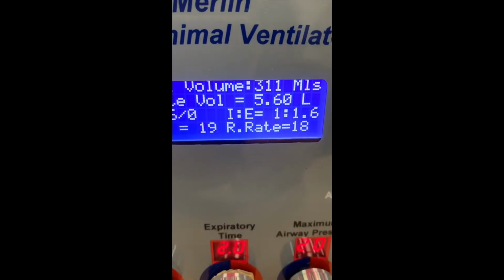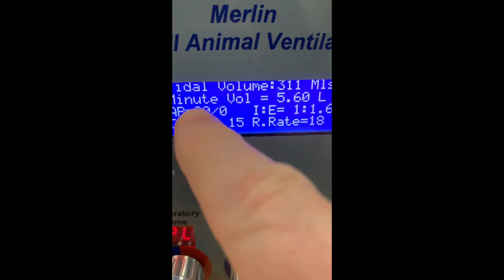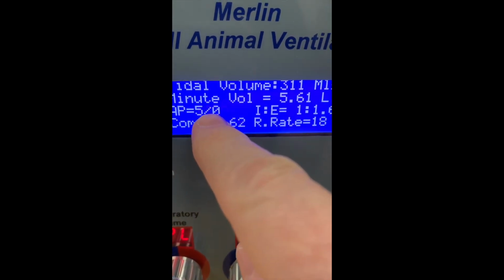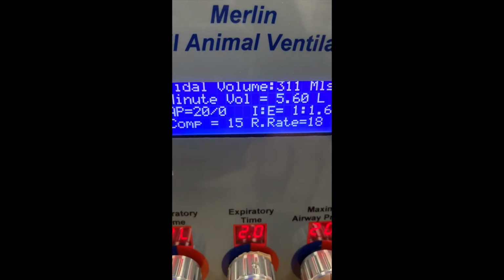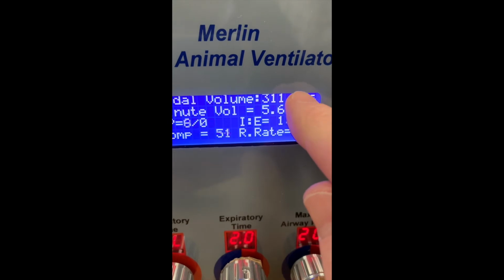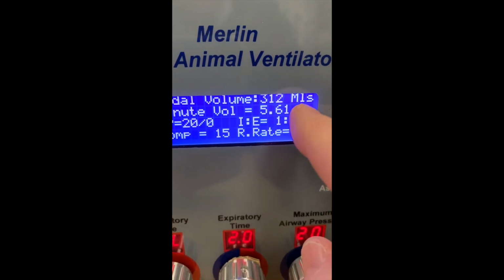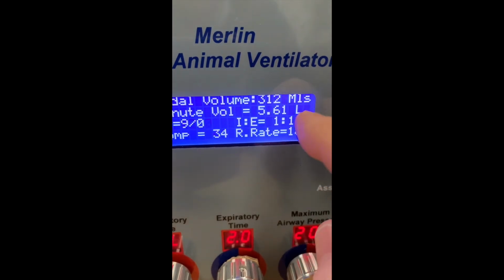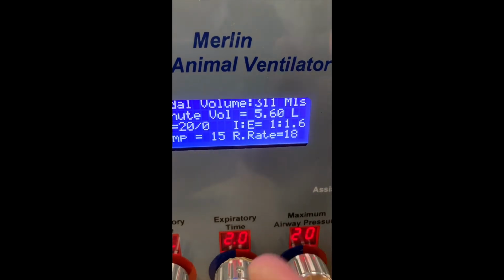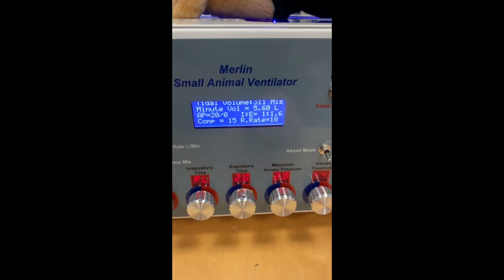So we can see now that the airway pressure reaches 20, that's our target. So flow is sent into the patient until it reaches 20 centimetres of pressure, and then it stops. The measured volume is 311, very close to what we had previously. And our minute volume is based on the total volume and respiratory rate as before. Our compliance is also still 15. We've now achieved the same ventilation parameters as we had before.